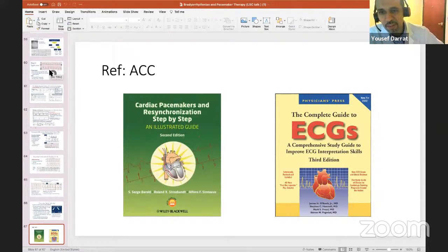This is the question about the magnet. With an ICD, you're just going to disable therapy. If the patient is dependent, it's going to be an issue. So basically you have to program the device. If you run into this situation where you have an ICD patient who is now dependent on the device and you're pacing, the magnet won't work. If you put the magnet on, you're just going to turn off tachytherapy and the patient will still inhibit with oversensing of cautery. So in that situation, you need to use the programmer.